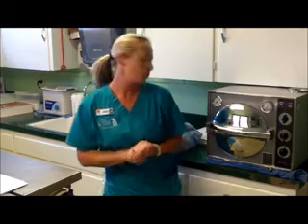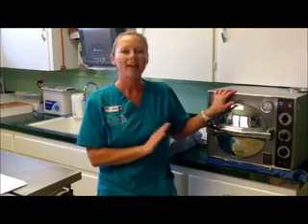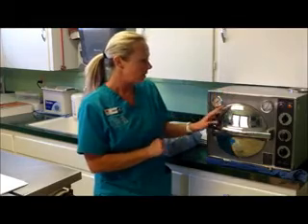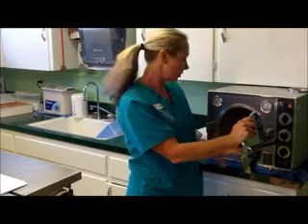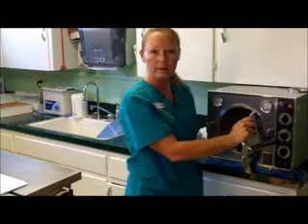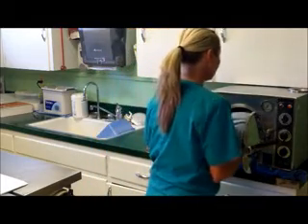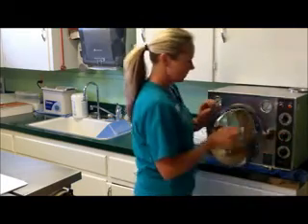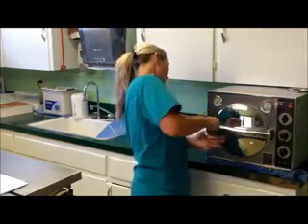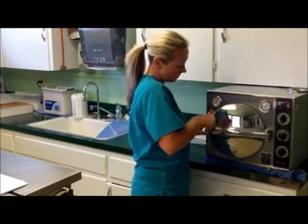This is task 18, autoclaving a pack. First, here is the autoclave. It's a gravity steam autoclave. We will open the door. It has already been filled with the water where it needs to be. So we will place our pack inside. We'll close the door, which is not an easy task to do.